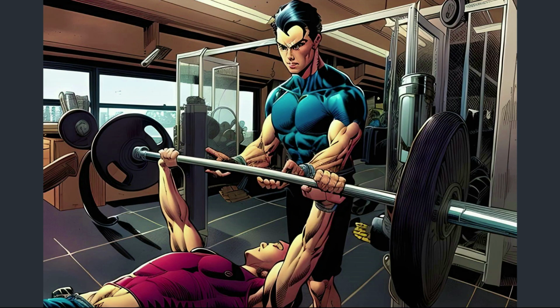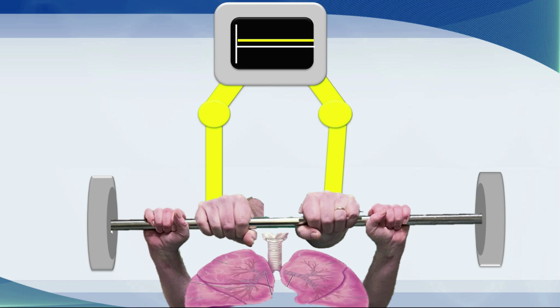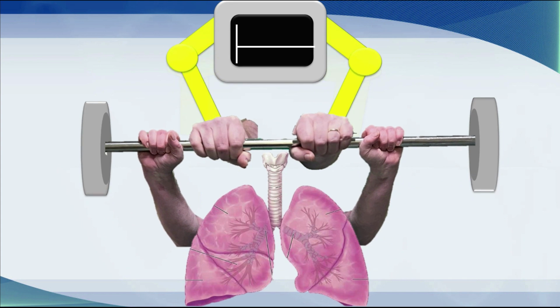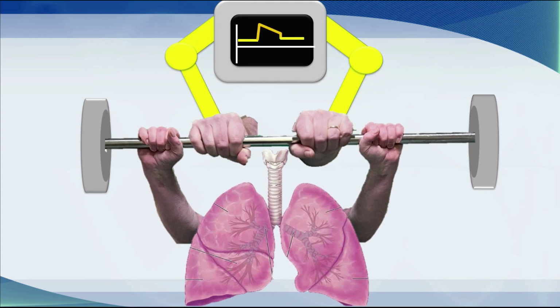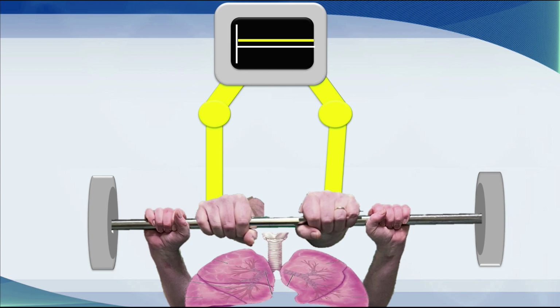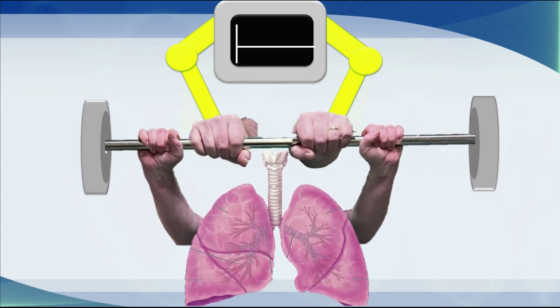For the next few minutes, I want you to think of the patient as the person on the bench trying to lift the barbell and the ventilator as the personal trainer who is providing assistance. At rest, the barbell is at the equivalent of functional residual capacity, or the FRC that is being generated by PEEP. Once the breath starts and the patient must initiate the breath, the ventilator provides assistance by helping the patient lift the barbell. This is manifest as positive pressure on the ventilator. And then elastic recoil brings it back to baseline and the whole cycle starts again.